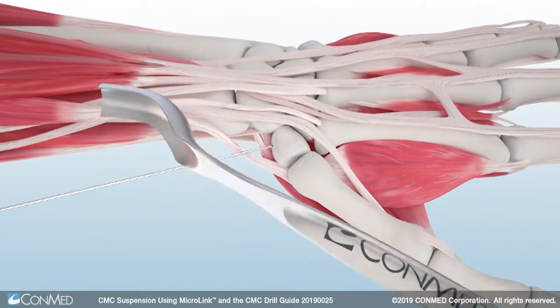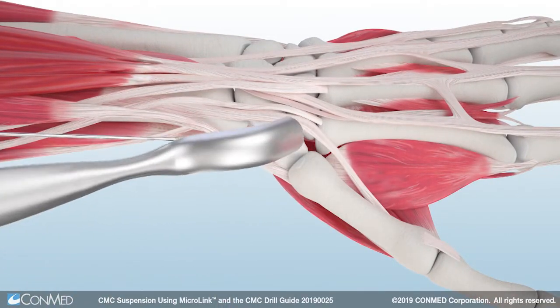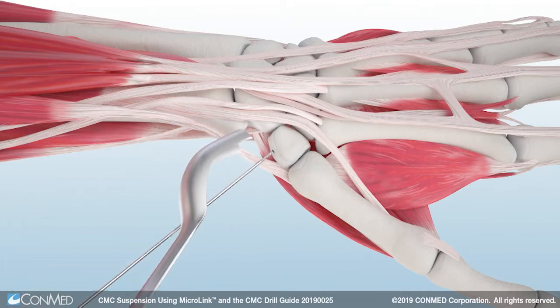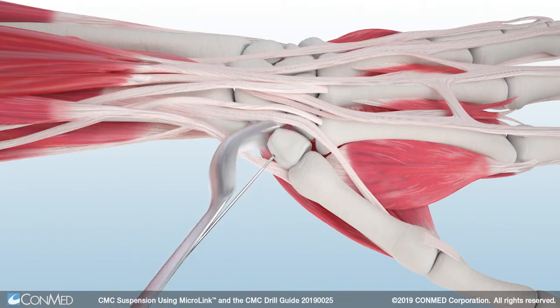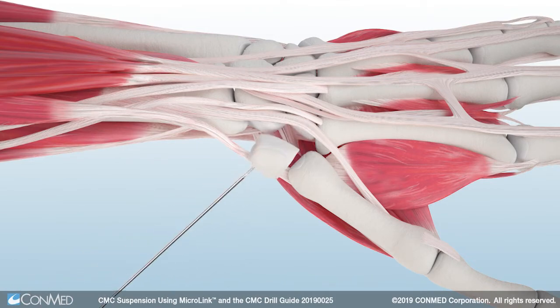Next, use the McGlamrey elevator, also offered in the Microlink system, to scrape soft tissue from the trapezium. Use the trapezium pin as a joystick to manipulate and remove the trapezium.